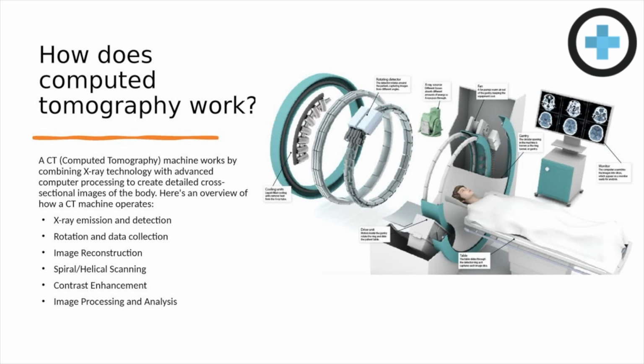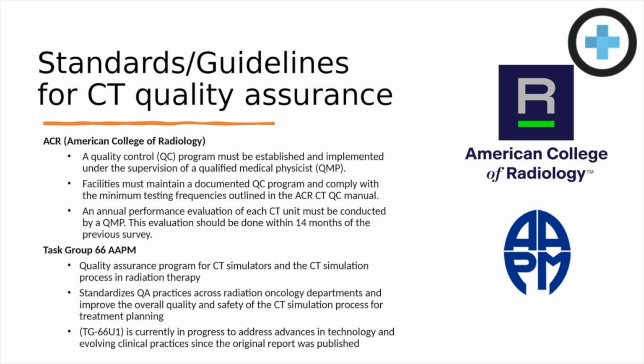Once the scan is complete, the images are processed and can be viewed on a computer screen. Radiologists can manipulate these images, adjusting contrast, brightness, and viewing angles to get the most informative view of the area of interest. CT scans typically take less than 15 minutes to complete, with most of the time really being spent on preparation. Technology continues to advance, and some of the newer systems are capable of imaging multiple energies simultaneously and help produce increasingly detailed images in less time. Now, regarding standards and guidelines, there are multiple ones out there.